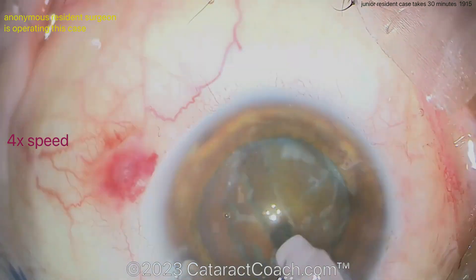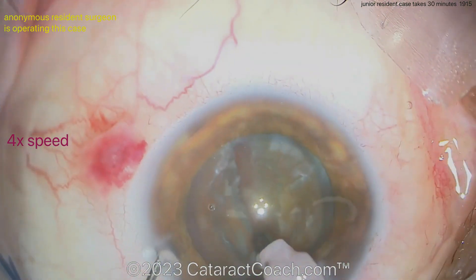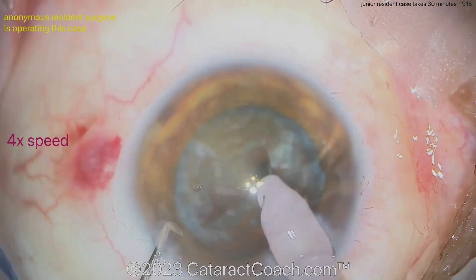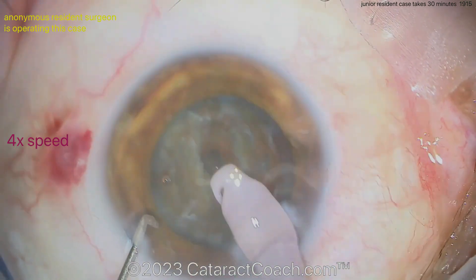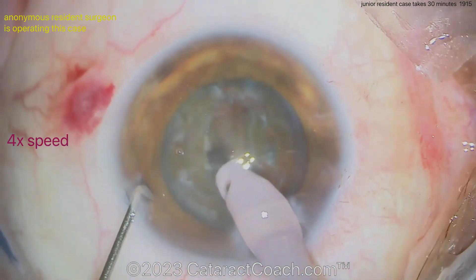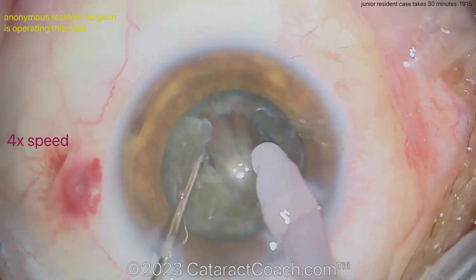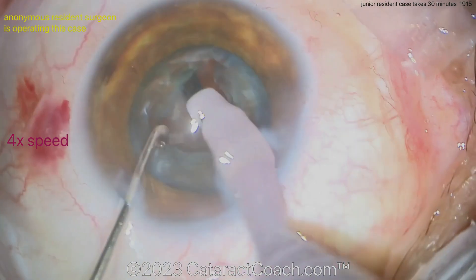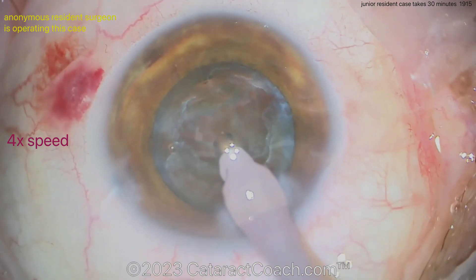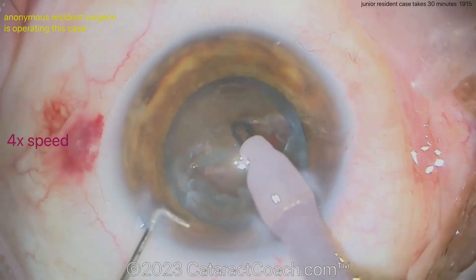Here's the phaco probe — looks like a groove down the middle, very clean and nice. The groove architecture looks pretty good: deeper in the center, less in the periphery. Now rotating it 180 degrees — you may want to use your second hand and chopper to help rotate the nucleus instead of just the phaco probe. Now splitting it down the middle and rotating again — try using both hands to rotate, you may find it easier.